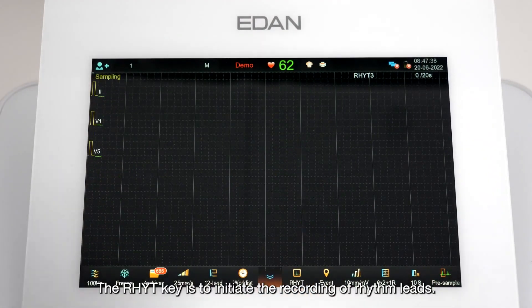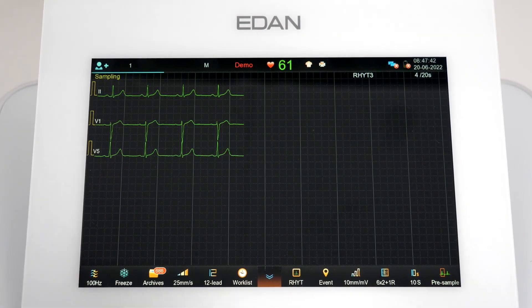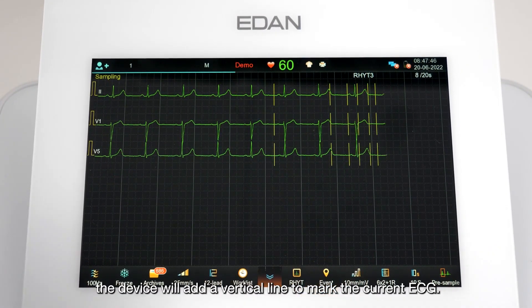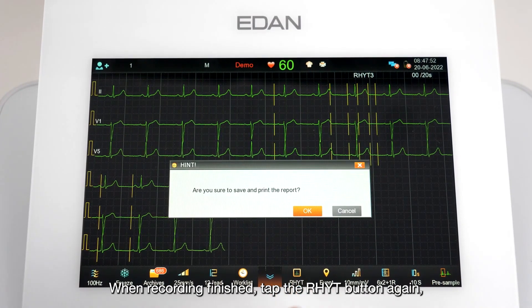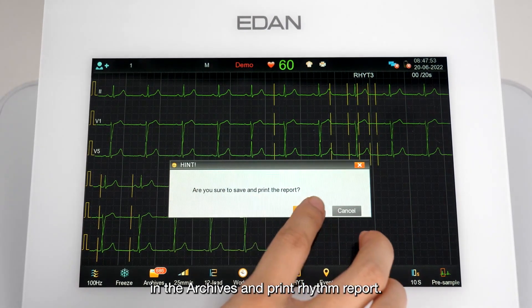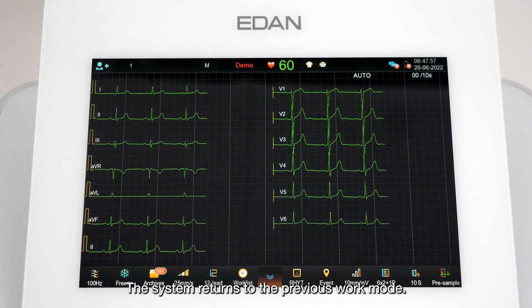The Rhythm key initiates the recording of rhythm leads. Tap the Event button and the device will add a vertical line to mark the current ECG. When recording is finished, tap the Rhythm button again. The system will prompt whether to save the rhythm data in archives and print a rhythm report, then return to the previous work mode.